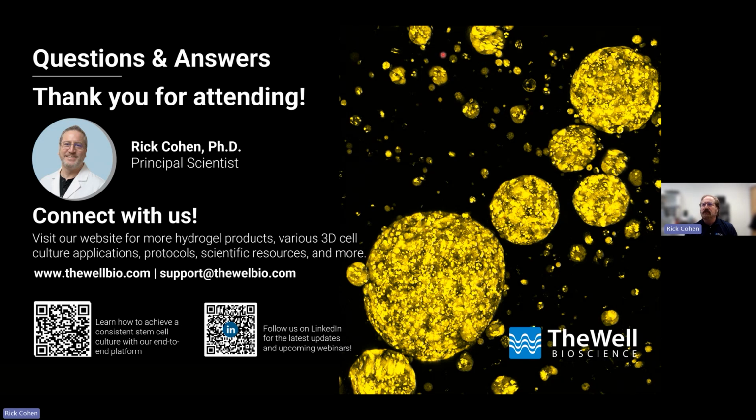And so if you initiate cultures in a non-homogeneous way, some outcomes are kind of strange because the larger ones may polarize over time. And that's not anything we could stop in any format because they just get too big, and maybe the middle will start to die or differentiate, almost like an embryo. And that's the point we make of the advantage of using it.